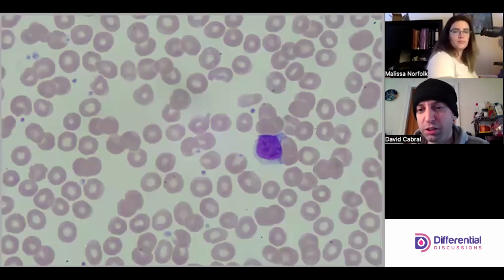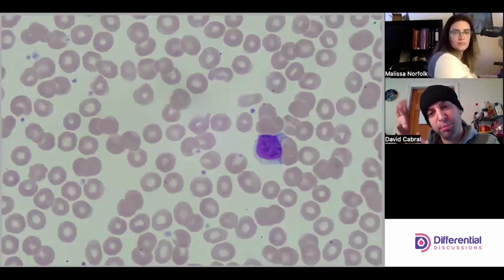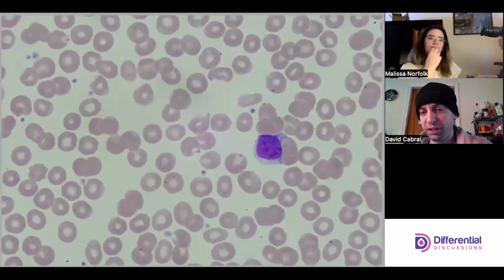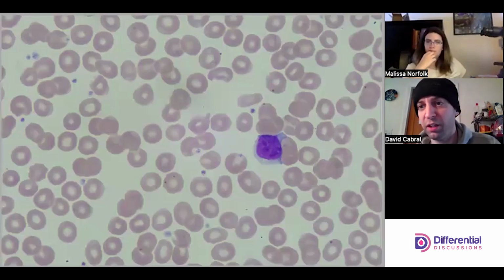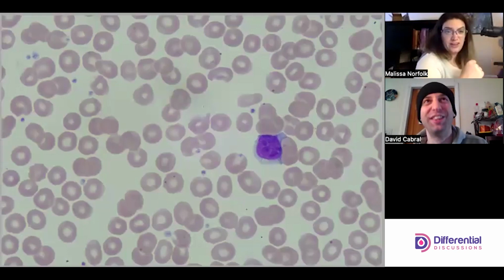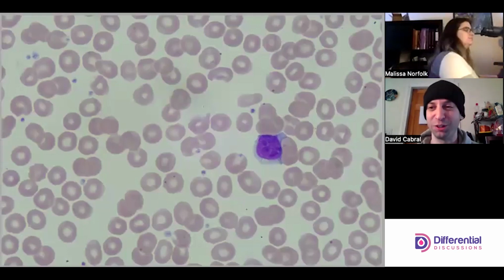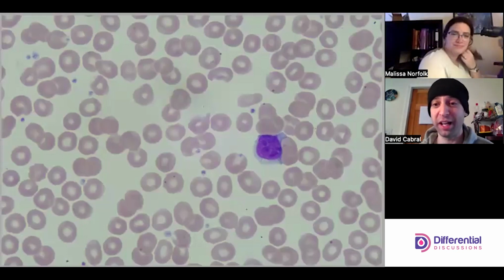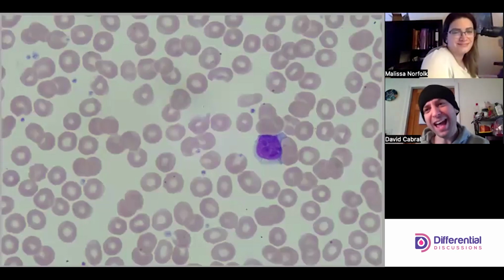Okay. So I'm seeing a little bit of blue, a little bit of touchy, and I thought that there might be a couple of reactive type cells. I would not classify this as reactive. I want to make that clear, but I'm looking at it and I'm noting its characteristics. It's doing more than just resting. It's just not quite reactive yet. That's right. There's a threshold for this stuff, and it's tough when you're instructing, right? Because the student would be like, "Hey, let's," and I'm like, "Yeah, but no."